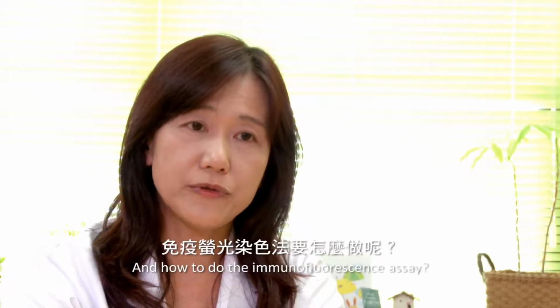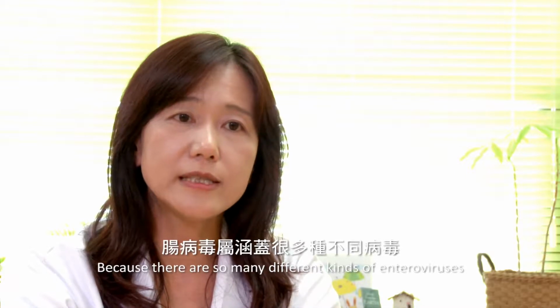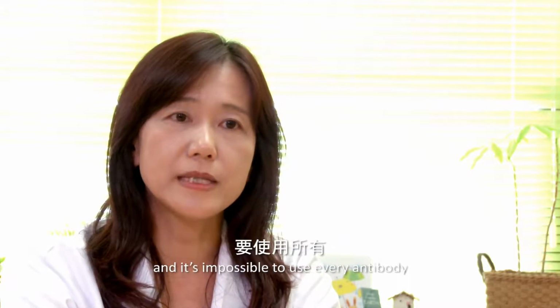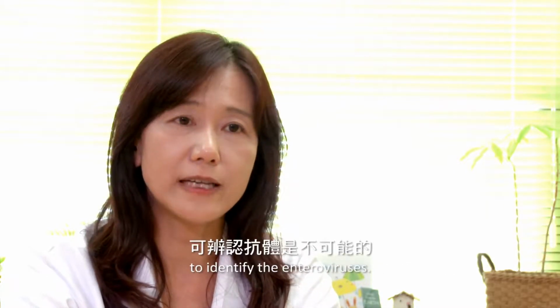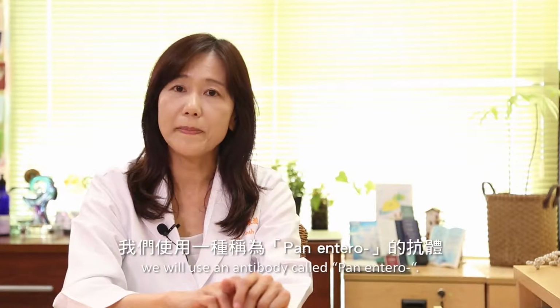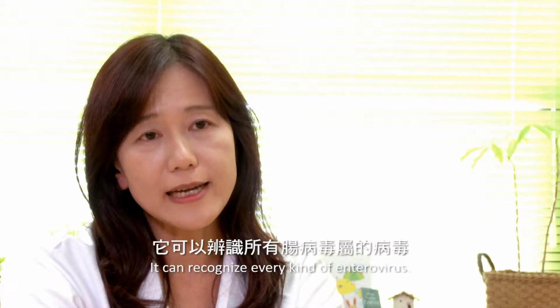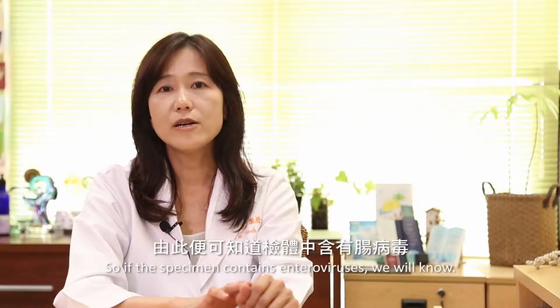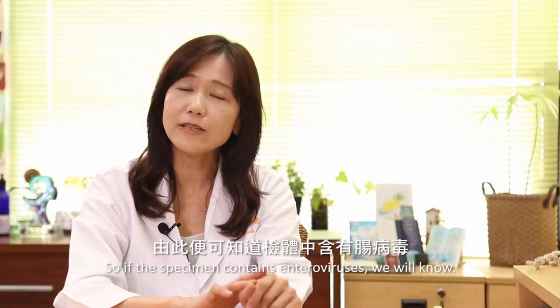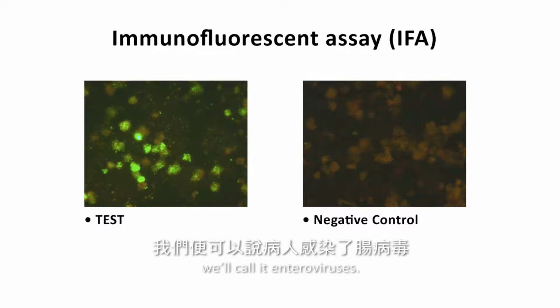And how do we do the immunofluorescence assay? Because there are so many different kinds of enteroviruses, it's impossible to use every antibody to identify them. So in the beginning, we will use an antibody called pan-entero antibody. This antibody is quite special. It can recognize every kind of enterovirus. So if the specimen contains enteroviruses, we will see a positive signal, and we call it enterovirus.